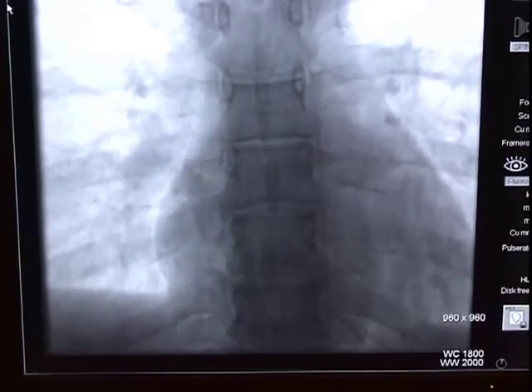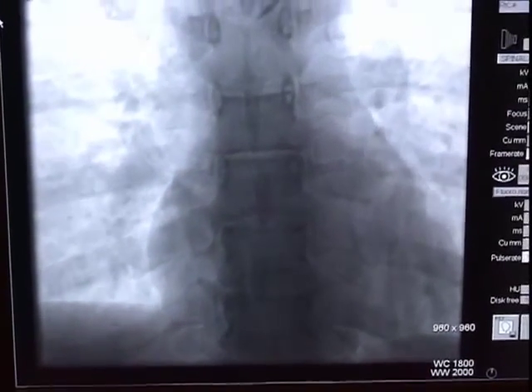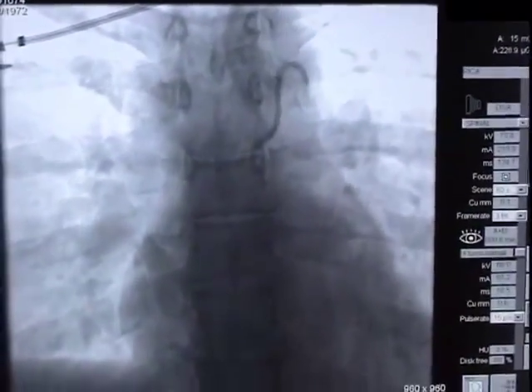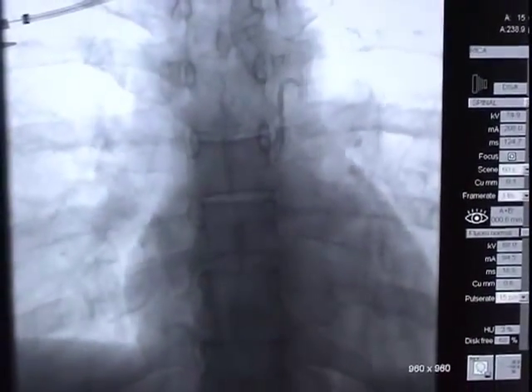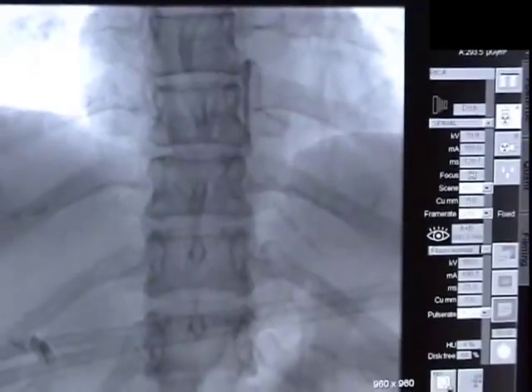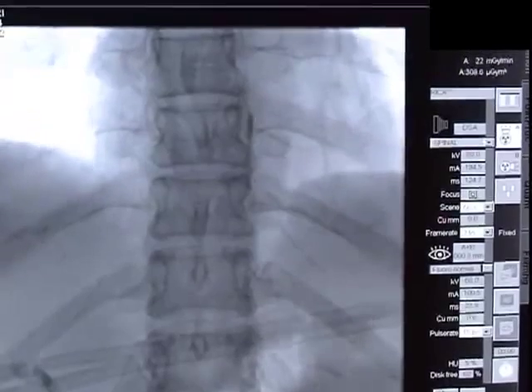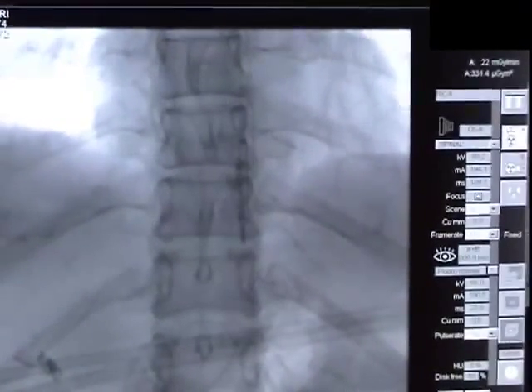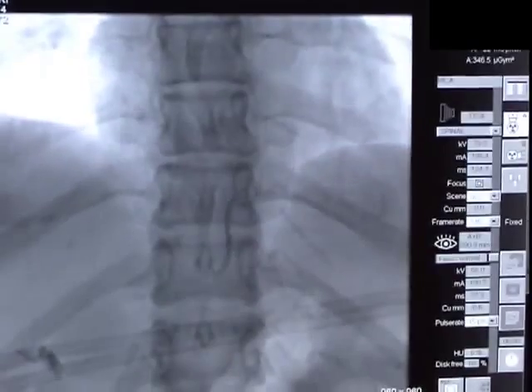We can see the vertebral bodies and the ribs. The catheter will be gradually positioned in the aorta, and we will begin to place the tip of the catheter into individual spinal radicular arteries. Here we can see the catheter entering different spinal radicular arteries, as we position it at a particular level.